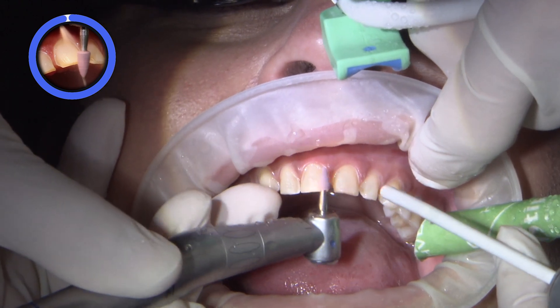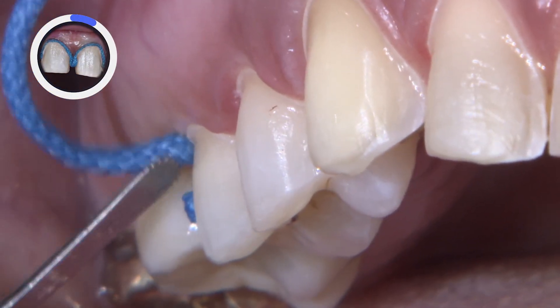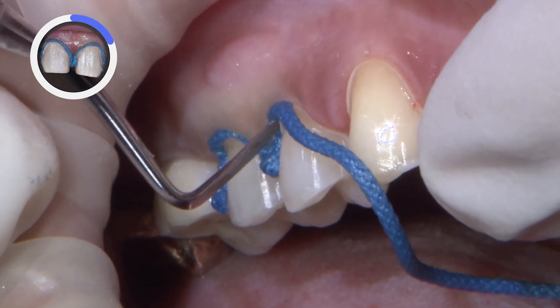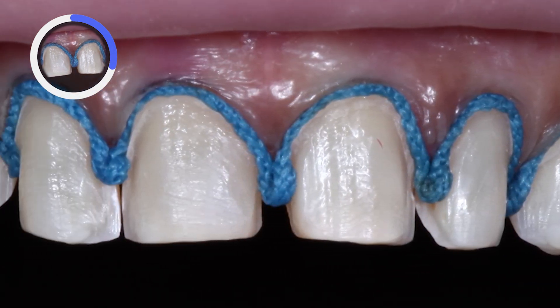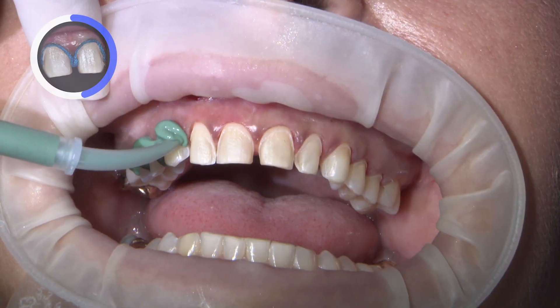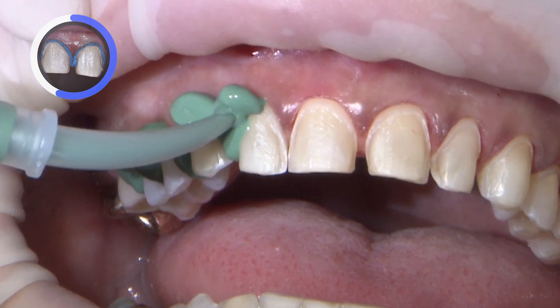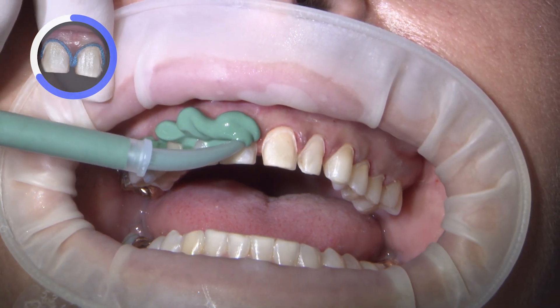All of the finished margins terminate at the free gingival margins of each tooth. I typically use a dual cord technique but wanted to try something a little bit different. Since all the prep margins are at the free gingival margin — right equigingival — I'm going to place only a size one retraction cord along all of the teeth to help displace the gingiva slightly for our final impression. Once the retraction cord has been allowed to sit for five minutes, we'll remove the cord and then begin flowing capture light body PVS material along the margins and into the sulcus. You can see with just one cord how the tissue has been displaced enough to visualize the margins.